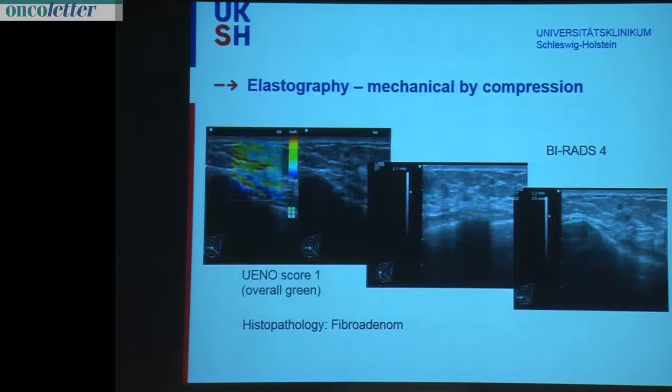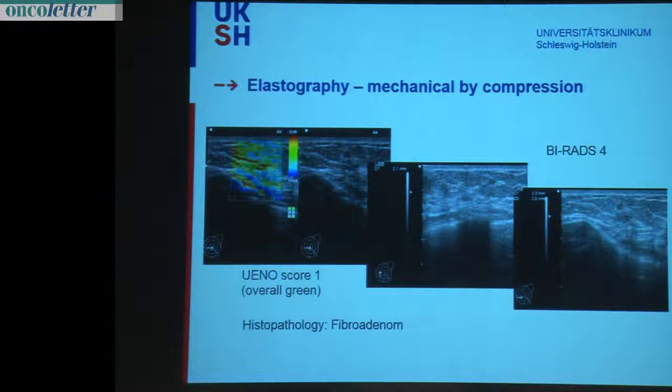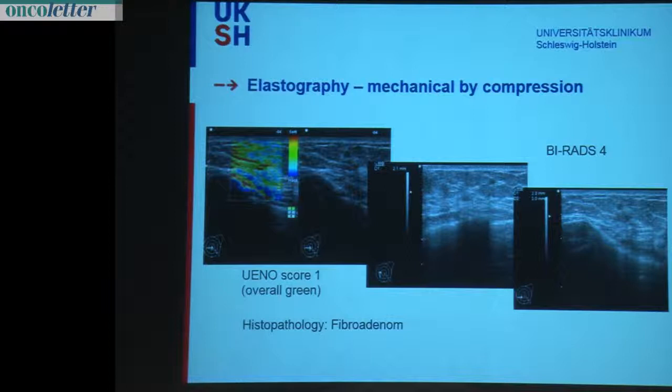We know different techniques. It started first with elastography by mechanical compression. Here you see a very small hypoechoic lesion in the breast. The scale shows blue for hard and red for very soft lesion in this system. Looking at the overlaying elastography, it's an overall green tone, so that's a very soft lesion.